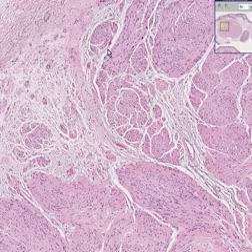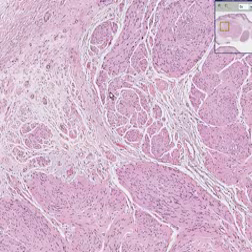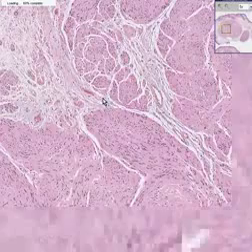If you saw that thing all by itself, you might call it a little nerve, and you'd probably believe it was, and so would experienced people. But when you see it as part of this whole tumor, you know it's not a nerve, but it's a proliferation or true neoplasm of the cells that comprise peripheral nerves, which are called Schwann cells.